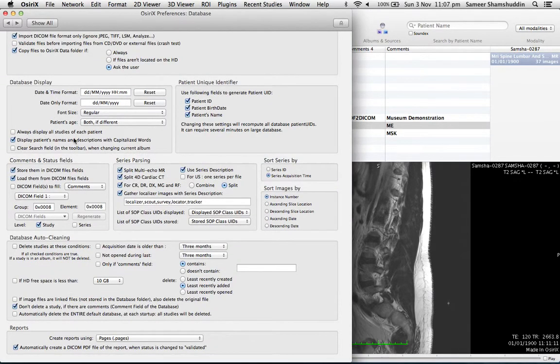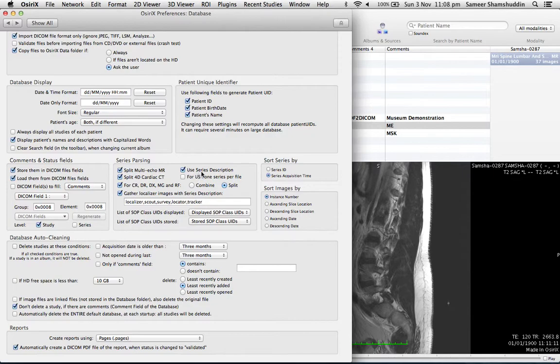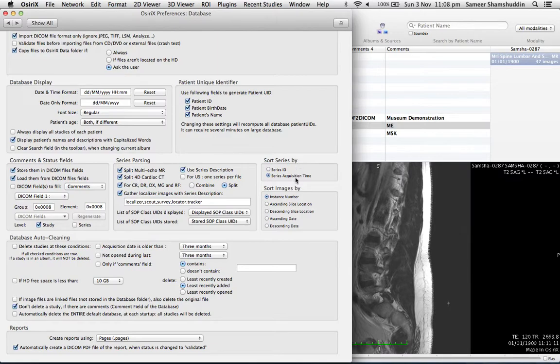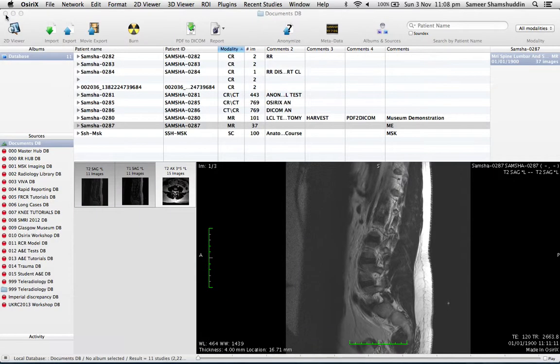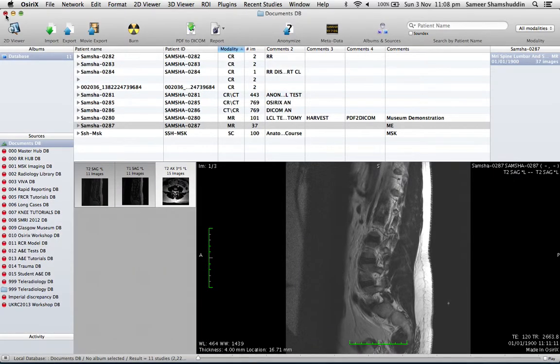In this database, in the middle part of the screen, you can see that there is a section called 'sort series by.' This is by default set to 'series acquisition time.' That's why the T2, acquired before T1, is coming up in this particular case. So change this to 'series ID' and then close the window.